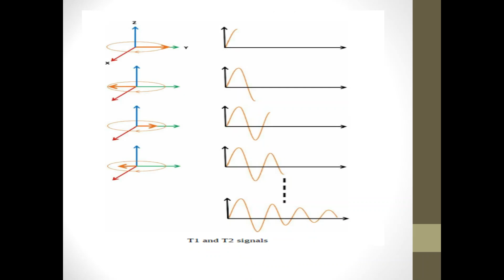As we see here, this is a signal which is coming out. We represent the signal like a sine wave. As you see here, the magnetization here is higher. This is after applying the radio frequency pulse. After we switch off the radio frequency pulse, we will find the magnetization spin in another direction, so the sine wave decays. After dephasing of protons, the magnetization Mxy is reduced, so the peak of the curve is not like before, and so on.